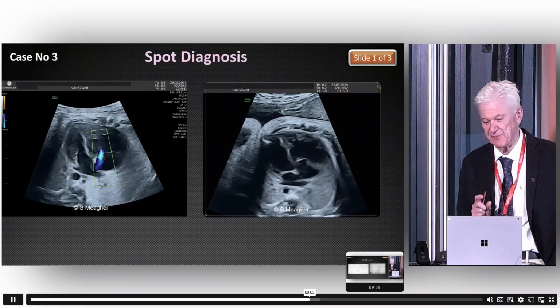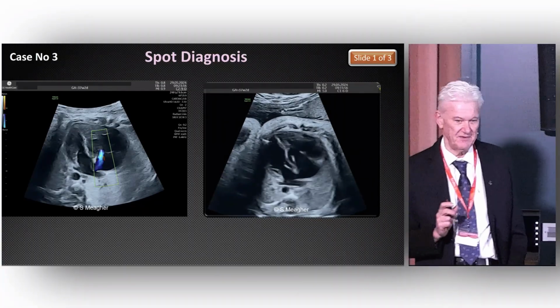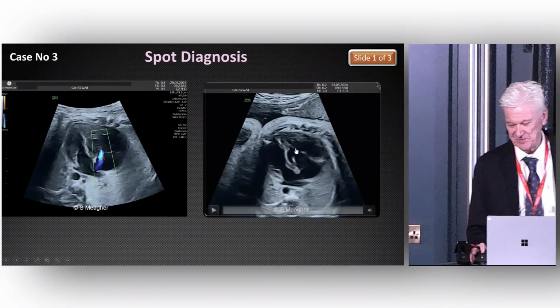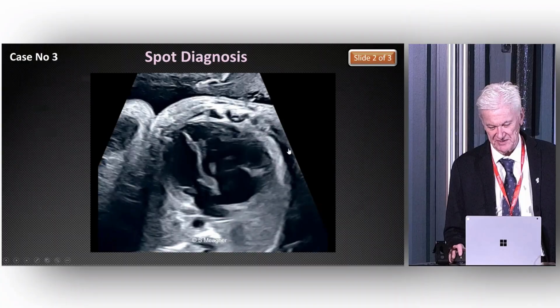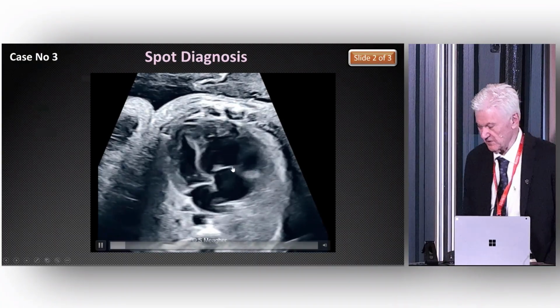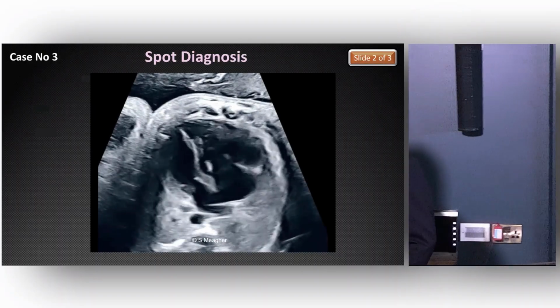So the movement of the apical septum and the movement of the septum in the region of the AV valves is different. And then the next observation, which is a very subtle observation, and I think it's on the next clip, is Cineloop. And I want you to look at the septal leaflet of the tricuspid valve and then the mitral valve.